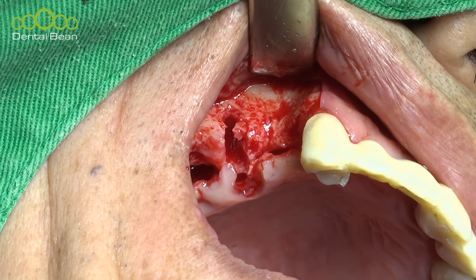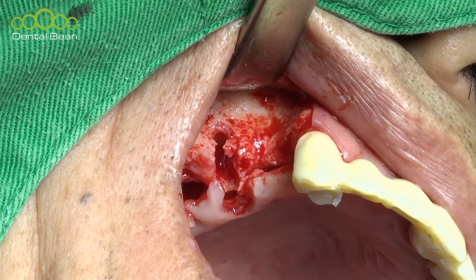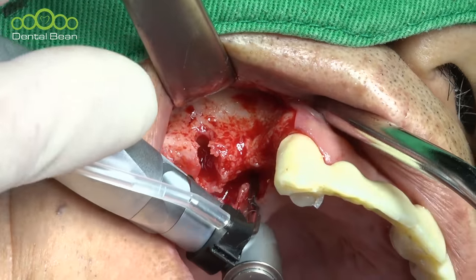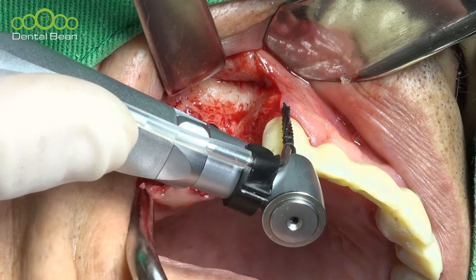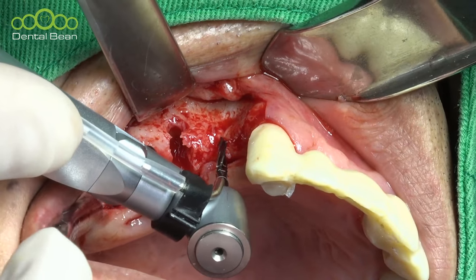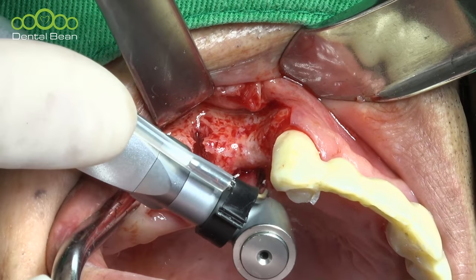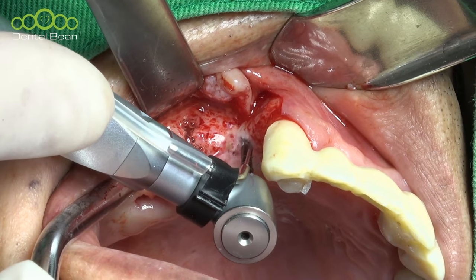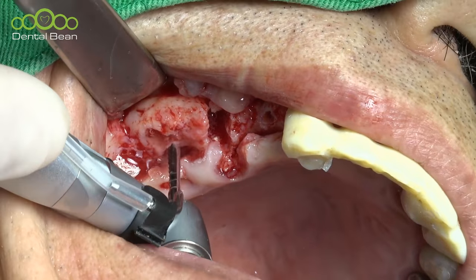Okay, hold it, please. I will start the drilling. So this is the canine angulation. So you can make some parallelism right here. So the lingual wall is good. So this area. Open.